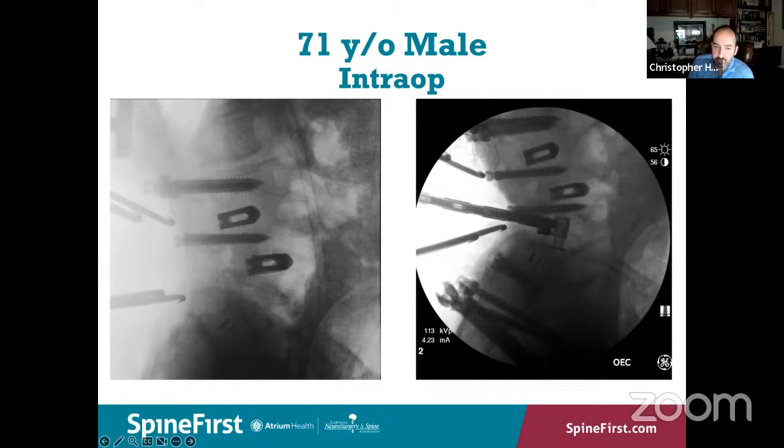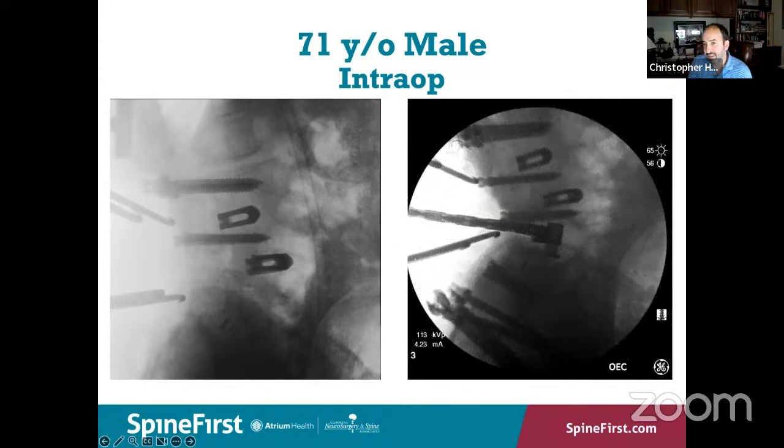Here are a few intra-op images. On the left, after we've removed the bilateral L4, L5 cages, one of which was in the spinal canal. And at right, this is the placement of the first expandable cage within the corpectomy defect. Ventrally, there was a lot of granular tissue, no evidence of infection, pus, or phlegmon, but lots of degenerative and inflammatory material that was scraped out, as well as some abnormal or partially degenerated bone removed. Here is the image after implanting the second cage. So a nice overlap there. You see just increasing density within the cage, as those cages are well aligned with one another.